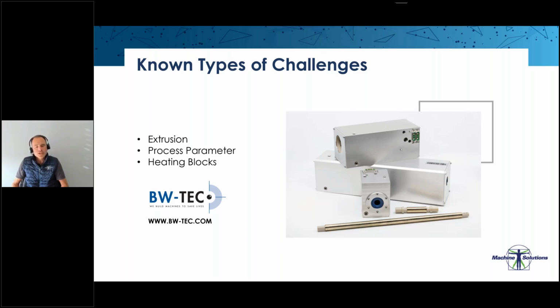Another thing that we see often is that we don't take enough time to find a balanced recipe. Balanced process parameters are key for consistency and high yield. Take the time during the R&D phase to develop a recipe that is designed in such a way that minor differences in the extrusion, different batches and so on, still allow a good quality balloon.